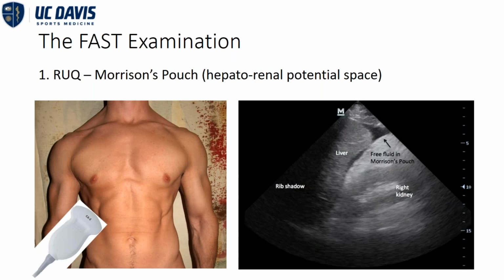So in the setting of a patient that is laying on the field, on the backboard, stretcher, gurney, whatever it is, in the supine patient, that's where this examination is most useful. Now, if you were to look at one of the 4 views, the best view to spend the greatest amount of time and the view that you never want to skip is going to be the right upper quadrant view.